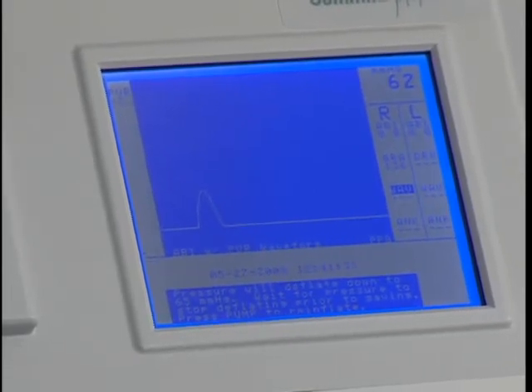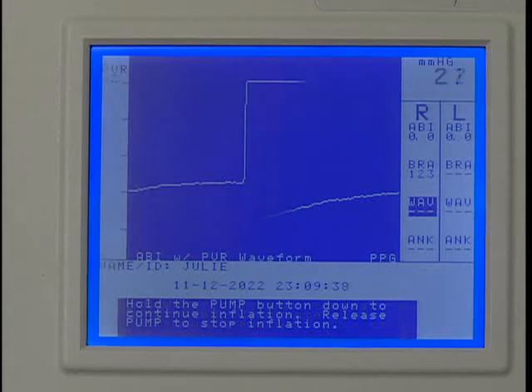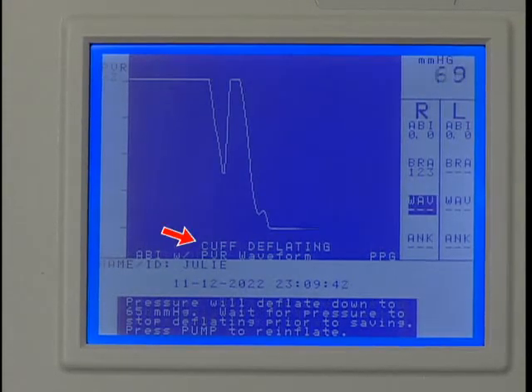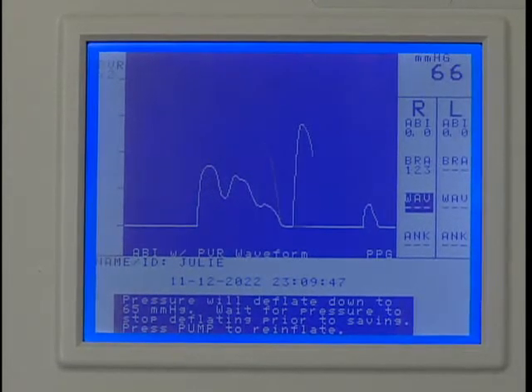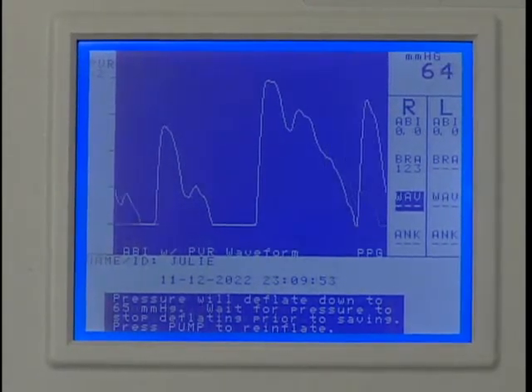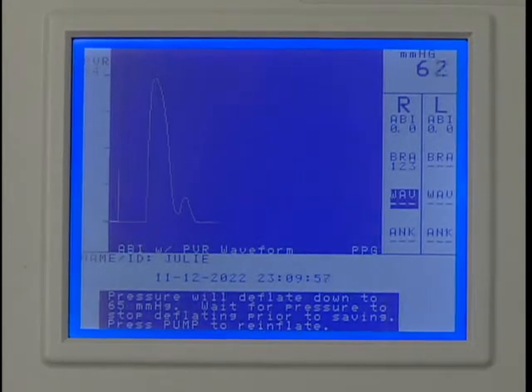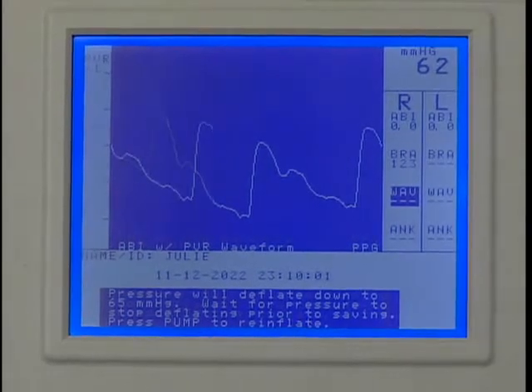Obtain the waveform using PVR. Press and hold PUMP to inflate the cuff to 75 millimeters of mercury. Release when the inflation automatically stops. Pressure will deflate to 65 millimeters of mercury for optimum PVR. Wait for the cuff deflating message on the display to disappear. If needed, use the SCALE key to optimize the waveform. After the waveform stabilizes, press FREEZE.